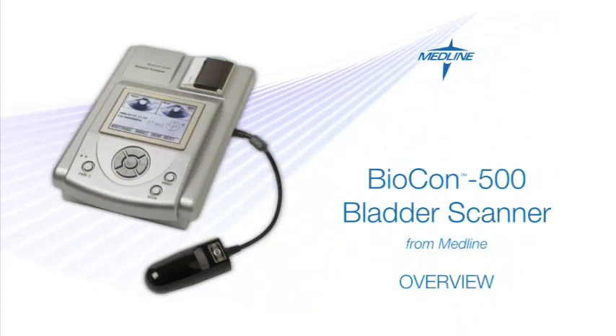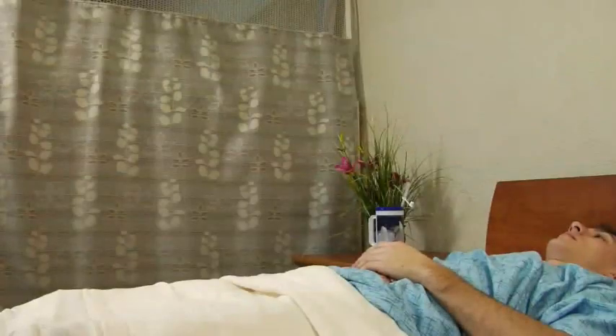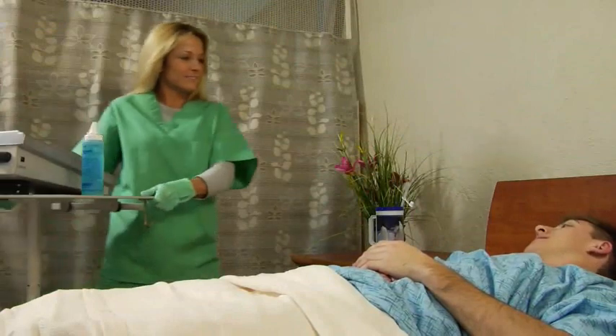There's no easier way to measure bladder volume than with the Biocon 500 bladder scanner from Medline. The Biocon 500 is a quick, safe, and non-invasive way to measure bladder volume and post-void urinary retention. Unlike some forms of traditional ultrasound, the Biocon 500 requires little training.